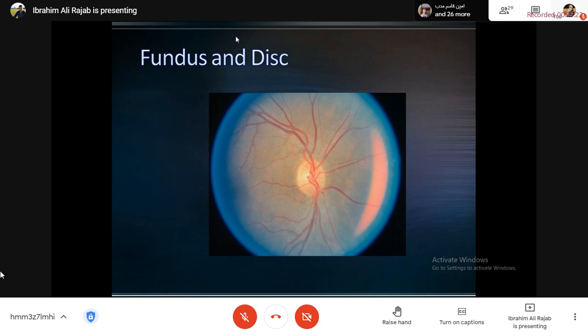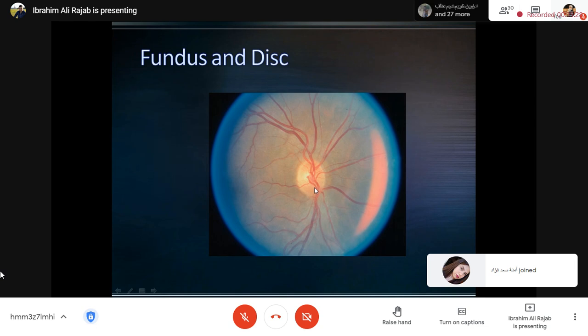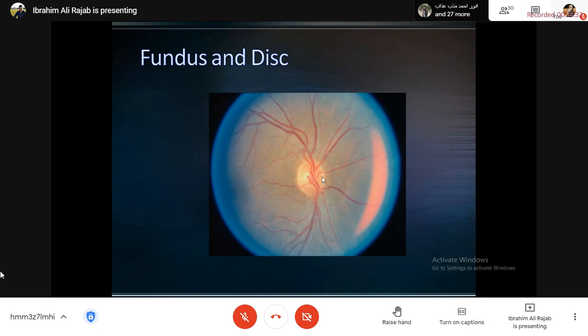If we see an abnormal blood vessel tuft on the optic disc, you will see later on in another lecture, this is maybe a neovascularization. A neovascularization may be due to diabetes or something else. This is abnormal, and this patient may be liable to hemorrhage. So you should know and you should describe the blood vessels.